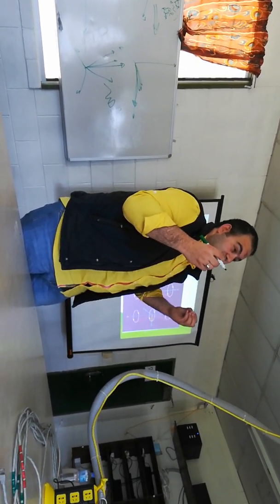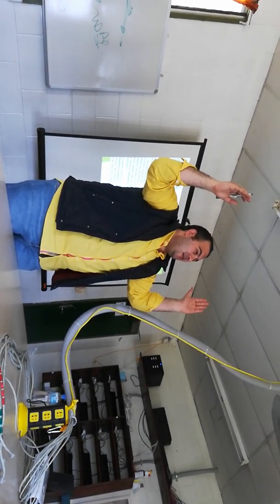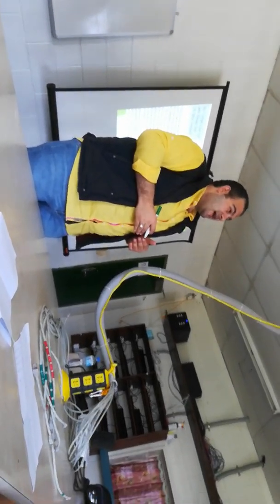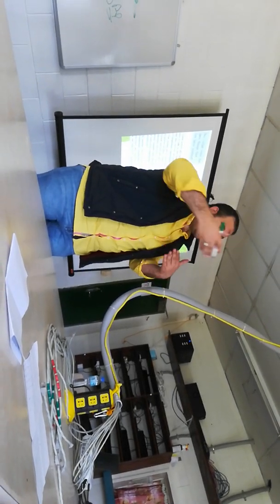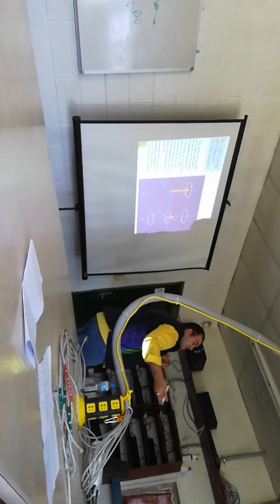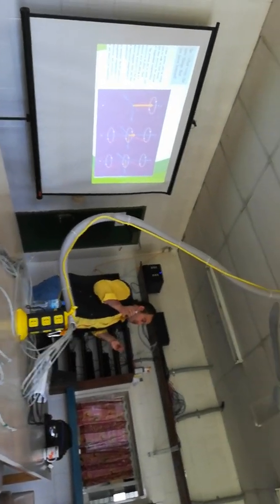You will get different signals because fat has fast excitation and fast relaxation. After a certain time, if you record the signal coming from fat, fat is already relaxed, so no signal comes from it. So now you will record the signal only from water. And next session we will talk about the difference between T1 weighted image and T2 weighted image in more details. But now the basic idea for MRI is clear.